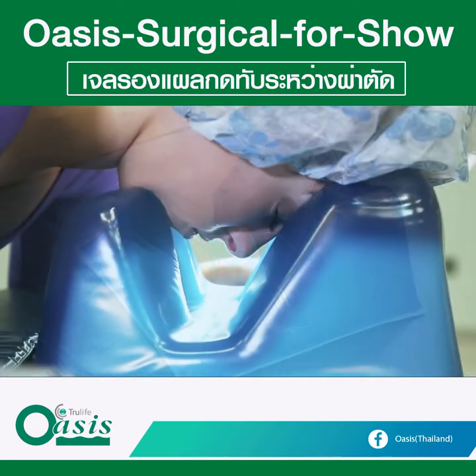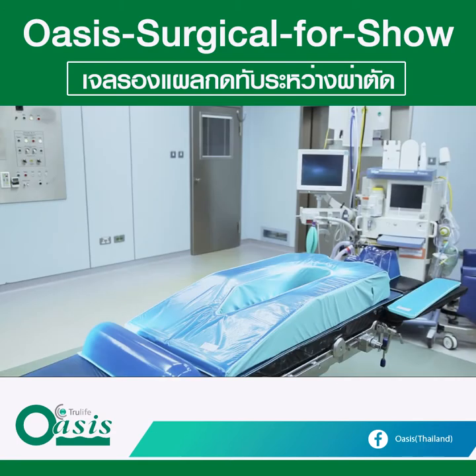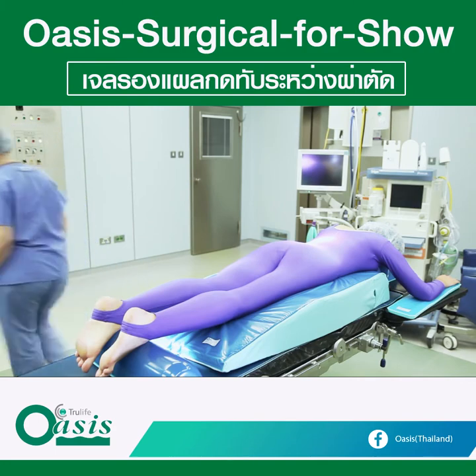Effective design of a prone headrest is vital in assisting with airway management as well as protecting soft tissue of the face. Prone positioners facilitate good surgical alignment and allow adequate ventilation by eliminating pressure on the abdomen.